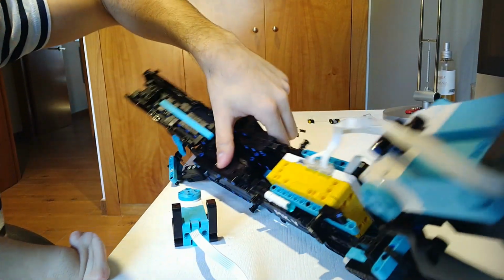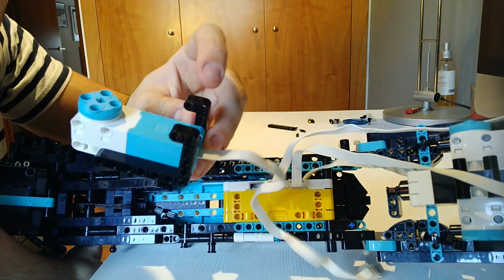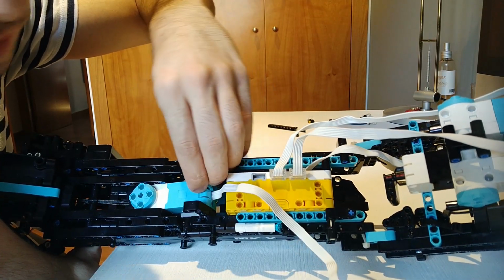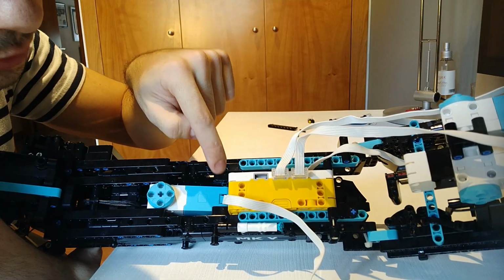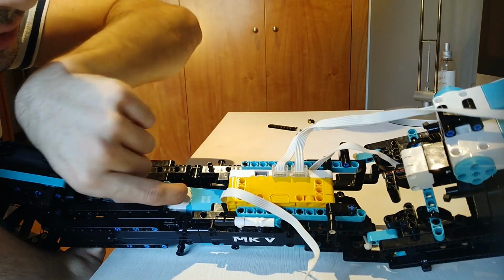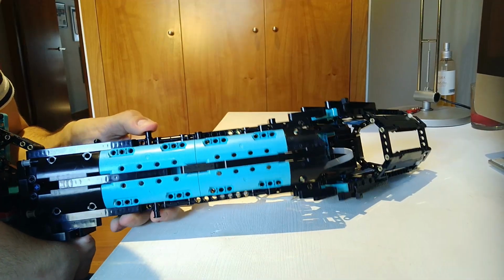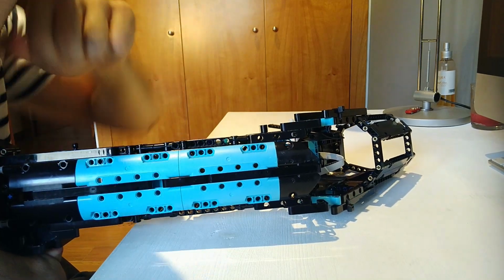So in order for you to see it, I'm going to turn the prosthetic all the way over. You're going to grab the L-shape lift arms and you're going to connect them first. Watch out because the front needs to go first inside so it fits perfectly. And you're going to connect the bricks on the same spot that they were before. And once you've done connecting the lift arms on top, you're going to need to connect the lift arms on the bottom. So you actually need to pull these pins inside. So it should look like this. Pin and pin are inside.